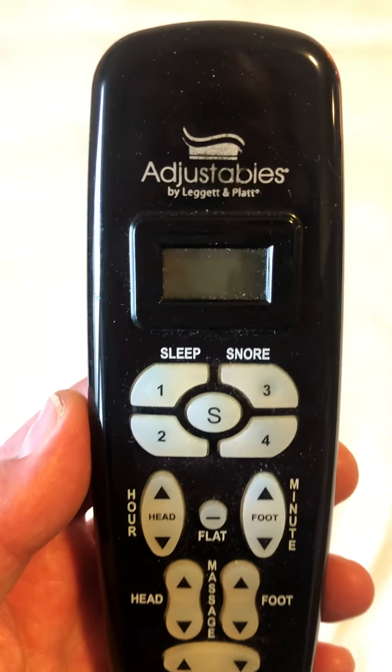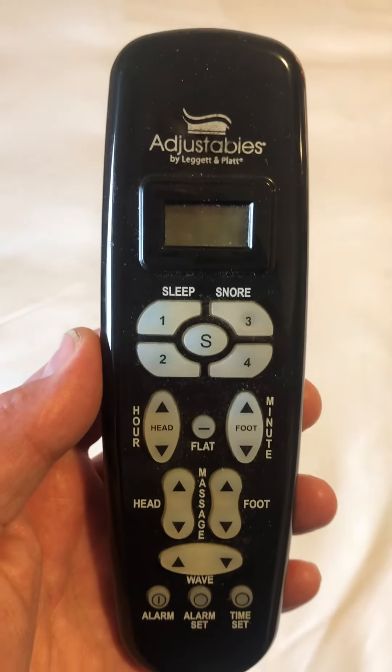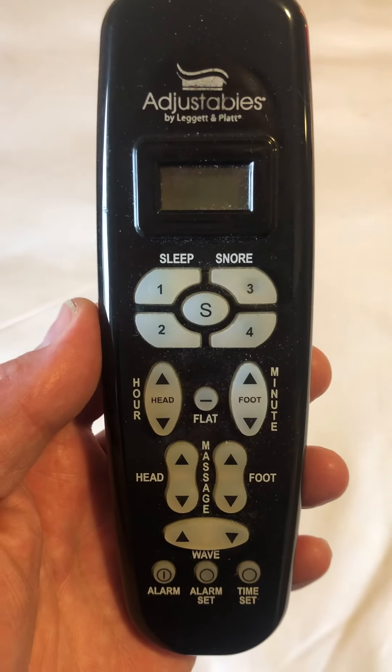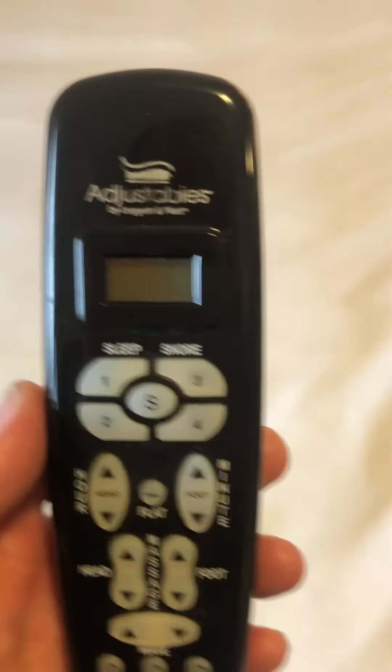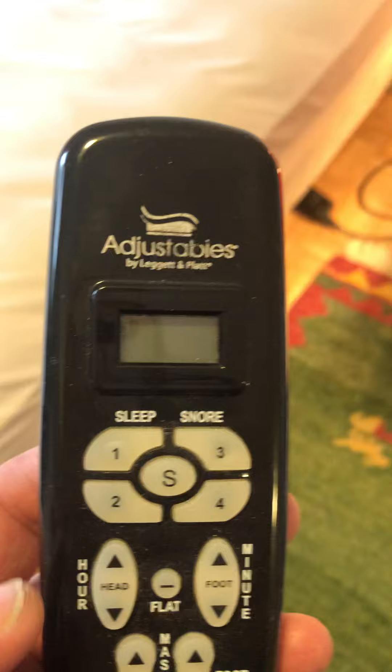As we walk around the complete perimeter you'll be able to see what kind of condition it's in, and then I'm going to show you how it operates. Here you can see nodules just coming up under the mattress — these vibrate and you can control that with a remote controller. It's from Adjustables by Leggett and Platt, so you can look that up on the internet. Here you see the adjustable that has the ability to raise foot and head.